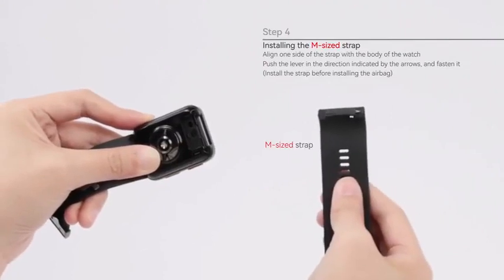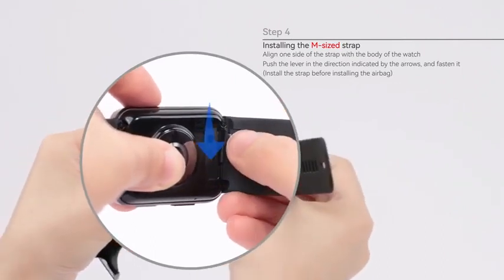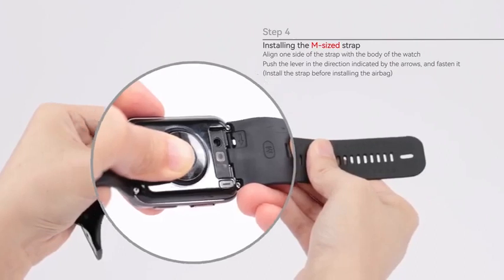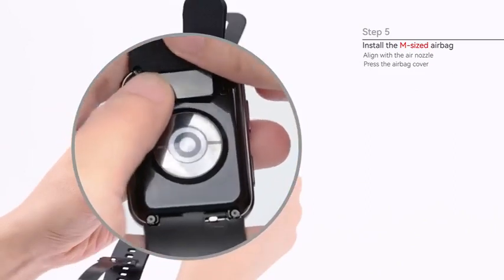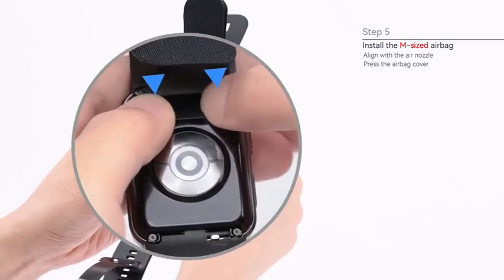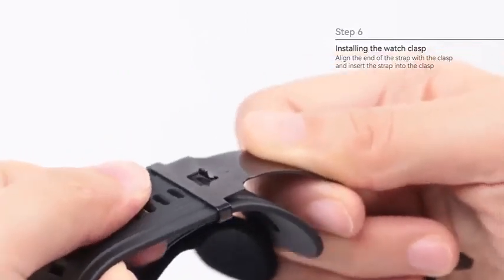Step 4: Install the M sized strap. Align one side of the strap with the body of the watch. Push the lever in the direction indicated by the arrows and fasten it. Step 5: Install the M sized airbag. Align the airbag cover with the air nozzle and press both sides of the airbag cover. Step 6: Install the clasp. Align the end of the strap with the clasp and insert the strap into the clasp.